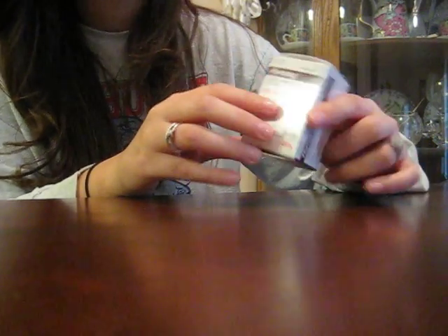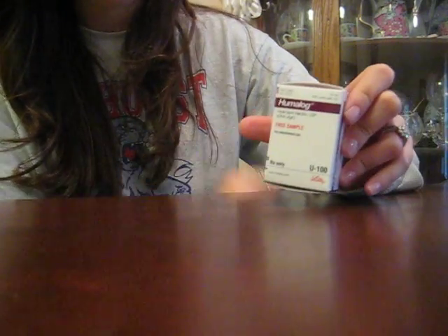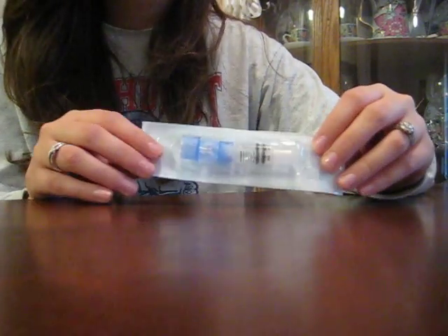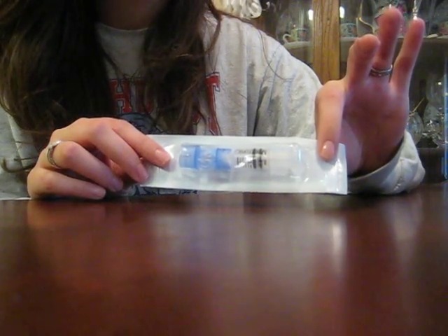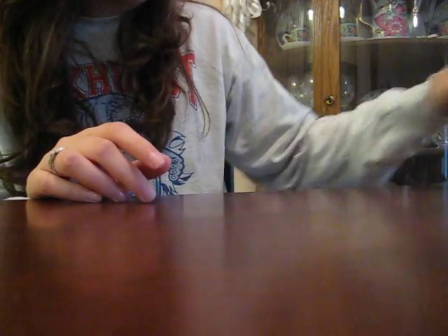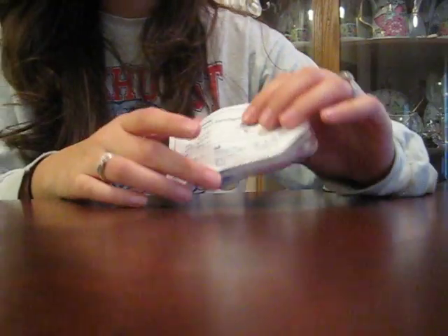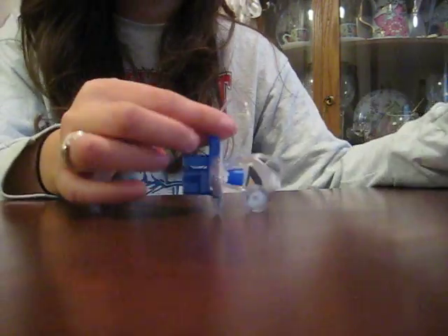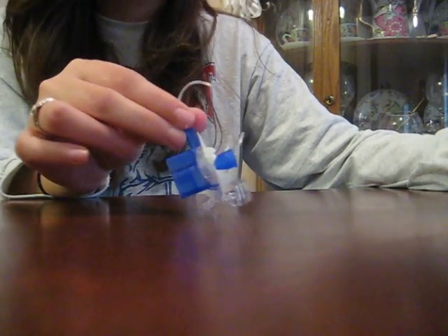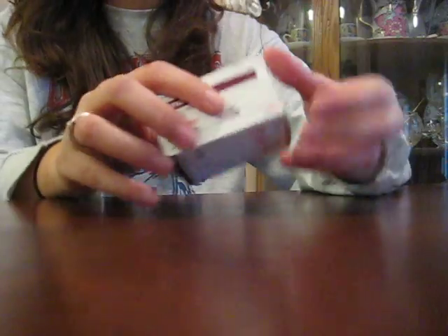First is the Humalog — the insulin. Second is the reservoir — if you take shots, it probably just looks like a rudimentary syringe. And then the third is the infusion set, which is the tubing and then the infusion set itself that goes inside your body, and I'll talk about that in a minute.